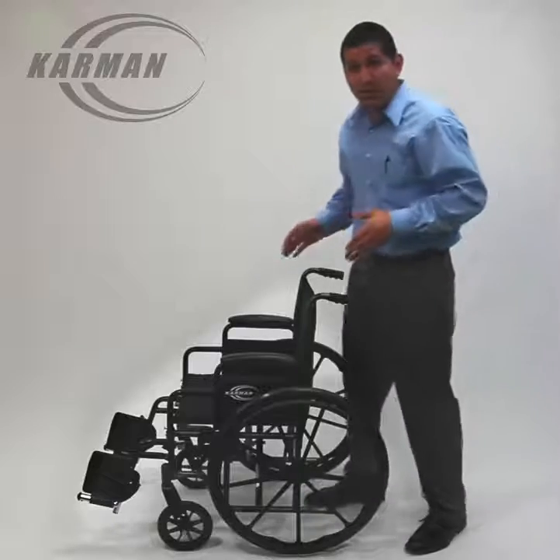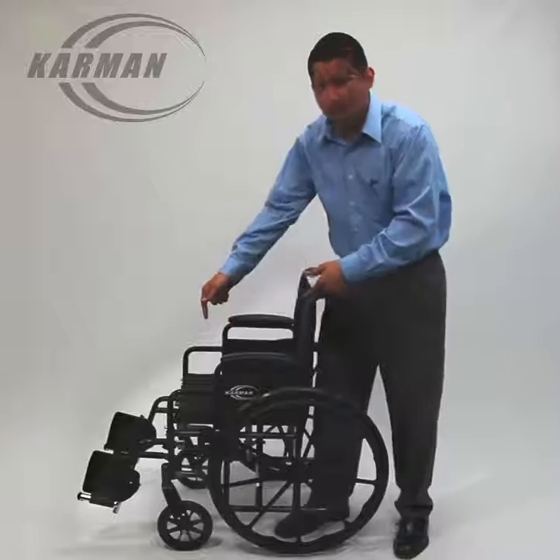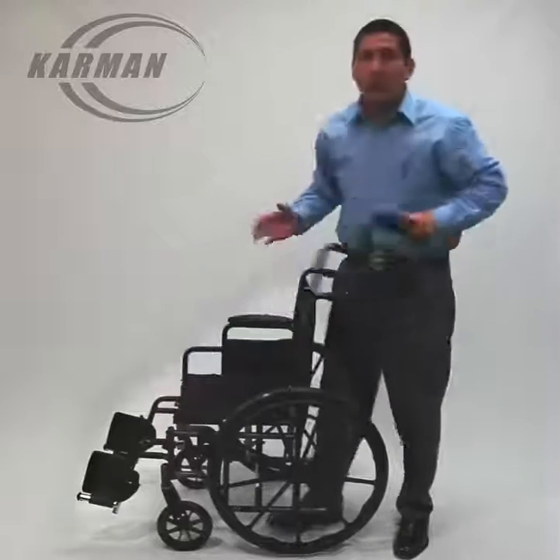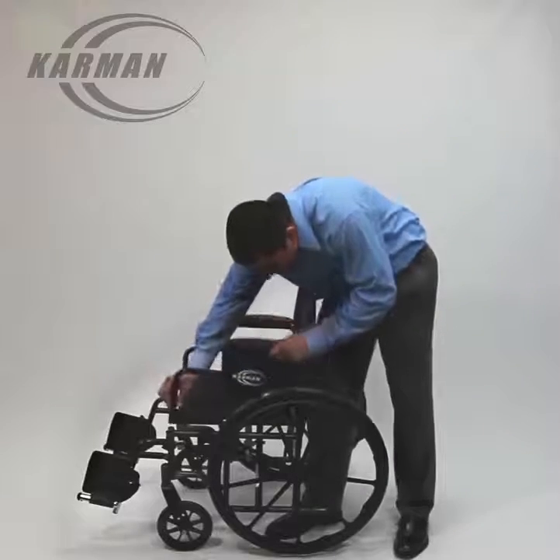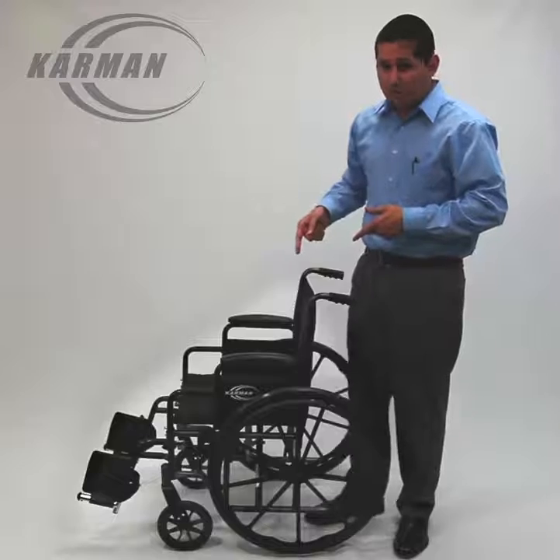Let me tell you the features this chair has. It is foldable. The armrests are actually detachable — let me show you how. Push of a button, very simple. One second, and it takes just the same amount of time to reinstall it. That's safety for you right there, folks.